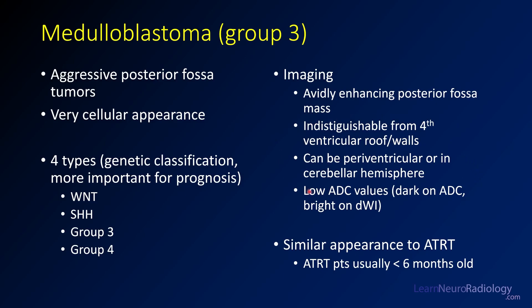They can be periventricular or in the cerebellar hemispheres, but they're often going to have low ADC values — dark on ADC, bright on diffusion. Their appearance is very similar to ATRT, but ATRTs are usually in patients less than six months old. So if you have a patient that's two years old or older, think medulloblastoma; if the patient is younger, think ATRT.